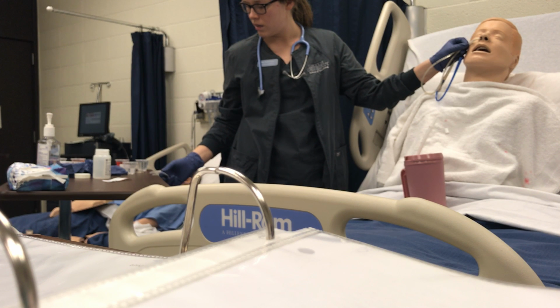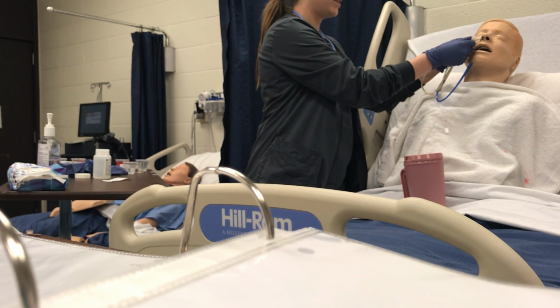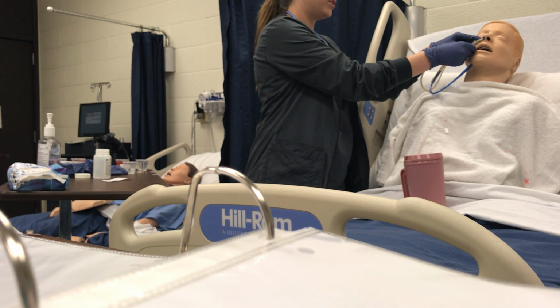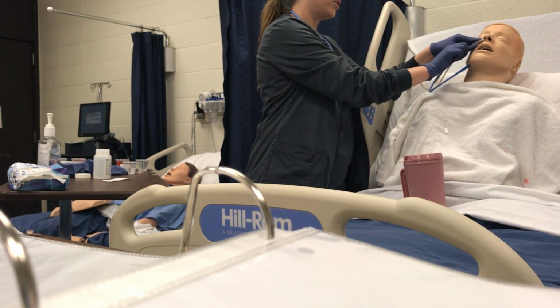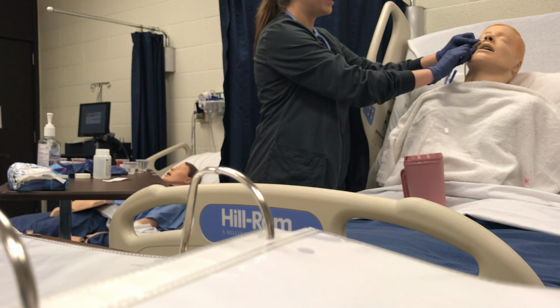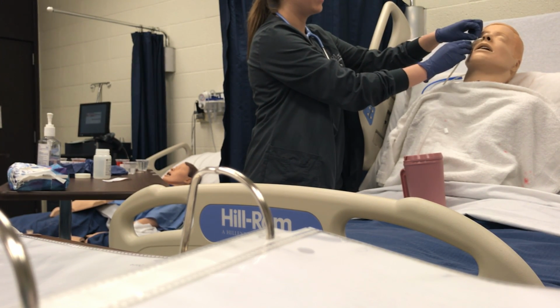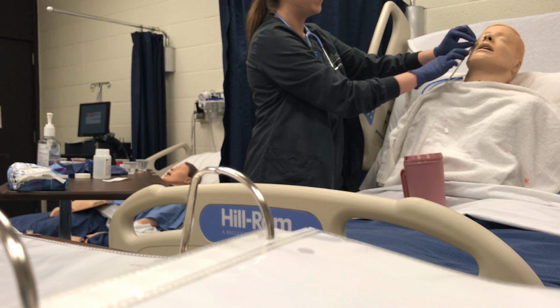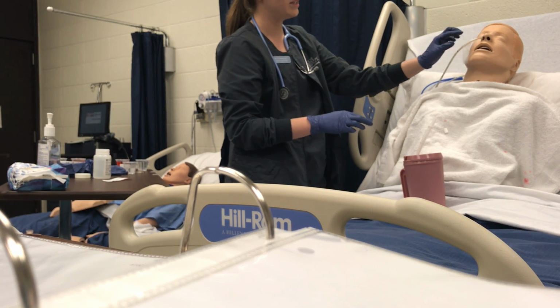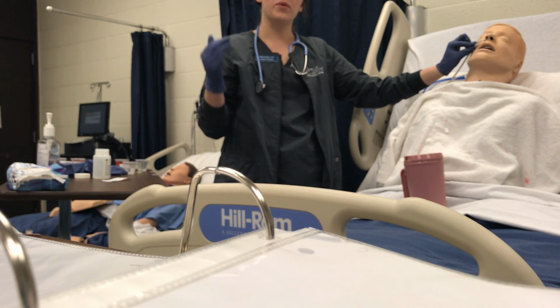I'm going to go ahead and secure this on his cheek for now, and we're going to ensure that we have correct placement before we would lock it in for sure. So 3 ways, hopefully that stays. It's not wanting to stick on the mannequin very well today, but that would stay while we tested. Okay, pretend it's staying. All right, so it's staying there, and we're going to test for 3 things.